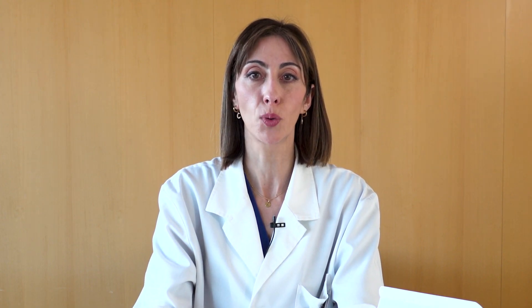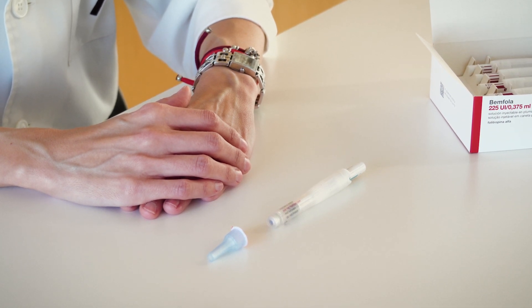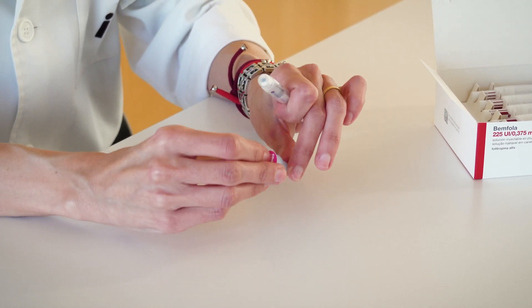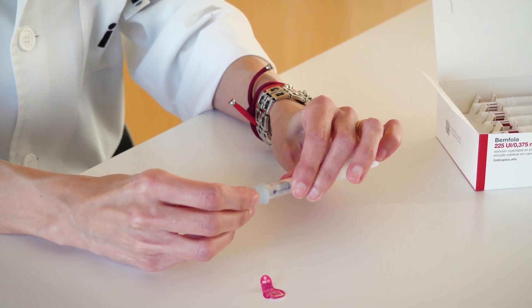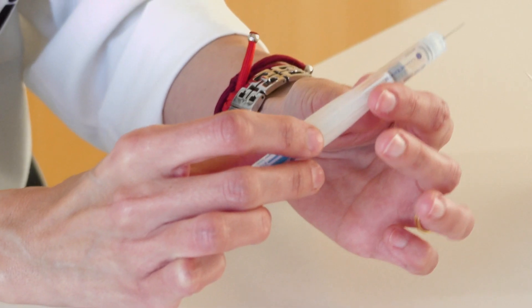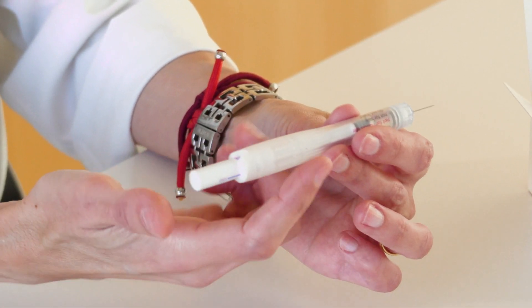Firstly, you must carry out a purge to remove potential air bubbles that may be inside the pen. The first step will be the installation of the needle. It is important to install the needle by pressing it in place, and in no case to screw the needle onto the pen. Remove all protections and press the plunger to the symbol so that a small quantity of medication spills out of the needle.